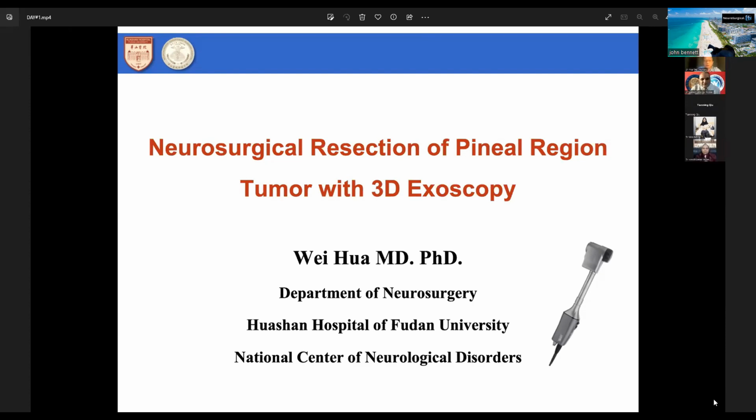This is a great meeting. I'm Dr. Huawei from Huashan Hospital, Shanghai, China. And thanks for the nice invitation from Dr. Hassan. Today, I will talk about the neurosurgical resection of pineal region tumors with the three-dimension exoscopy.